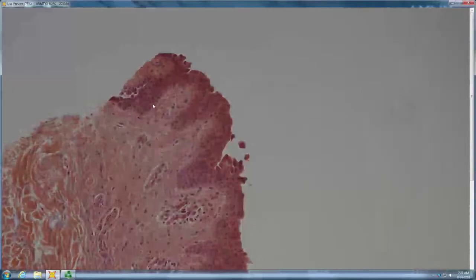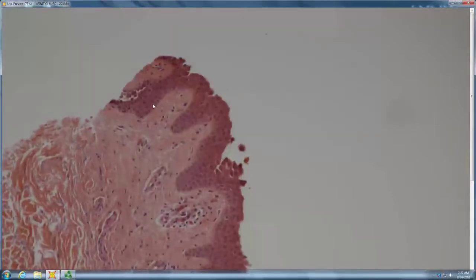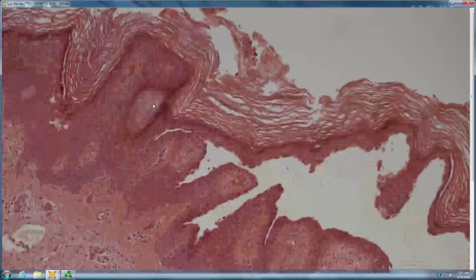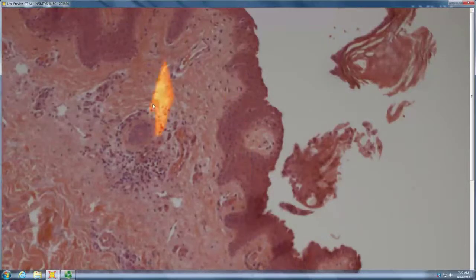Looks like the stratum corneum is just gone here, which makes you think of maybe it's foliaceous, and if it's in the granular layer split, that would certainly be good for foliaceous. The other thing that you have to consider is that vulgaris can have reepithelialization, right?